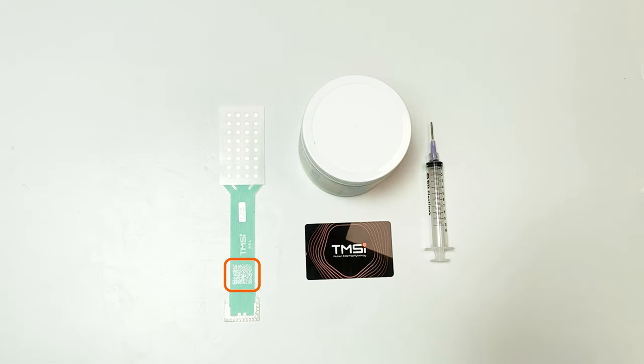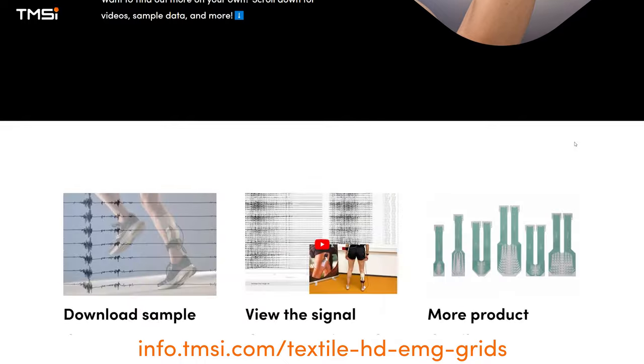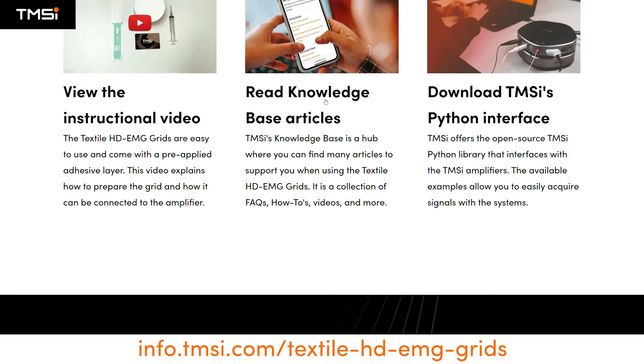Scan the QR code on the grid or visit info.tmsi.com/textile-HD-EMG-grids for a link to the helpful knowledge base and more.